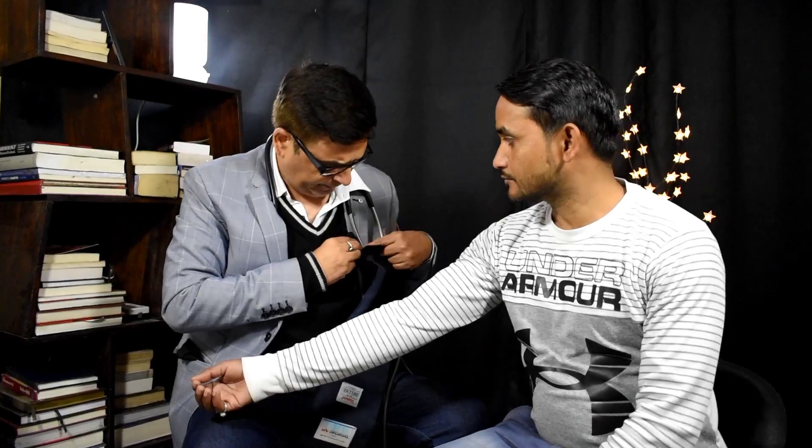BP ka cuff kaise baandhna hai, kitna upar baandhna hai, kitna tight rakhna hai — yeh kaam ki baatein hain. Yahan par jo gadda hota hai — jise hum kehte hain cubital fossa — yeh elbow hai. Toh elbow se do ungali upar rakhna hai, bas itna.